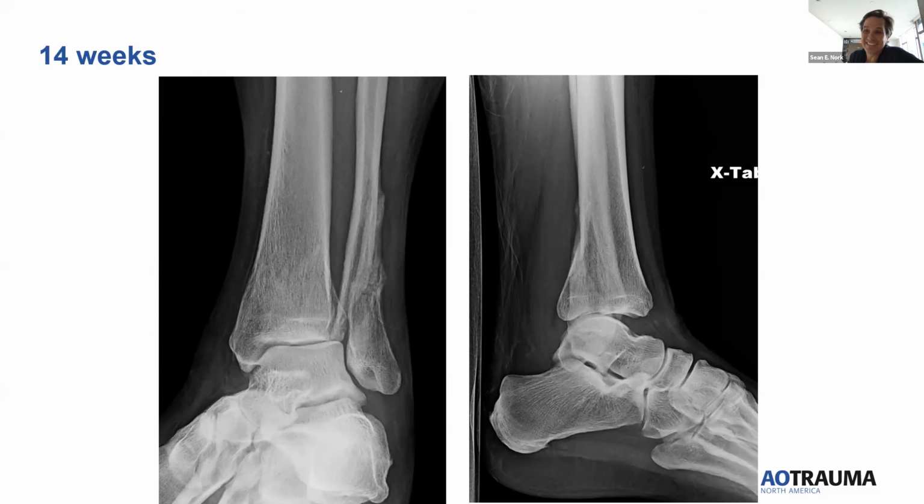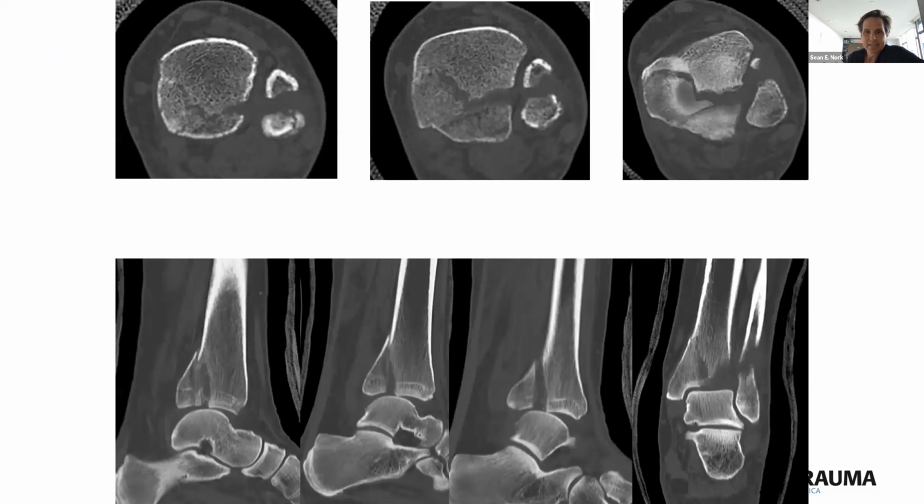Right. That is one of the more satisfying fractures about the ankle or tibial pilon variants, because there was no impaction. This was a pilon where one could truly get it perfect, right? Yeah. So this is the CT scan that was obtained maybe a week or two before. And it certainly shows what Brett referred to. The poor talus is just sitting right there on the articular edge as it's subluxated so far posteriorly. And you can see some callus formation within the gap of the original fracture.